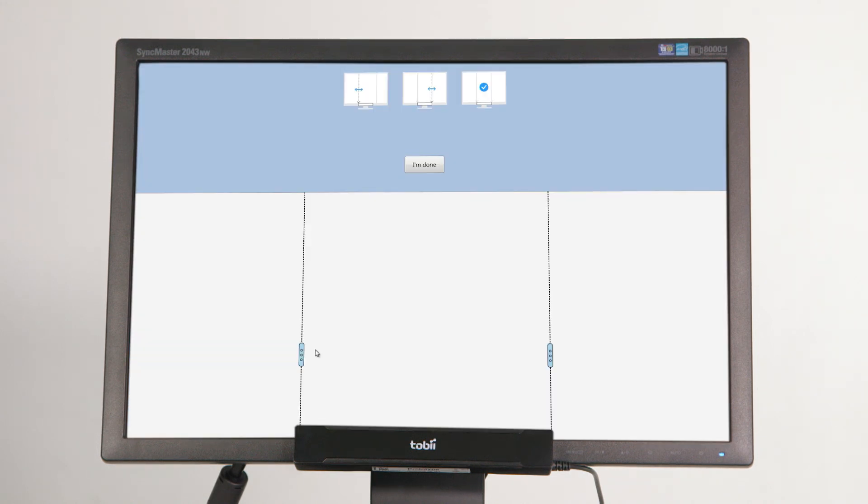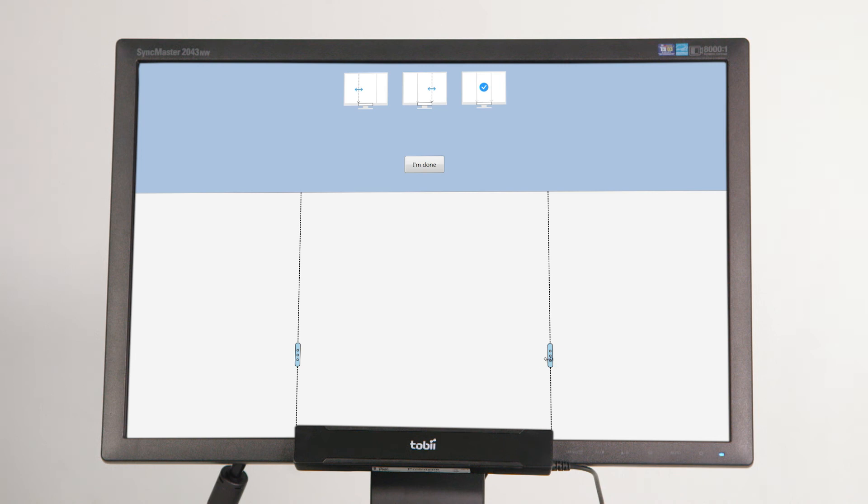Drag the light blue handles to move the data lines so that they align with the size of the Tobii X2 eye tracker. Once this has been done, click the I'm Done button to save the configuration.